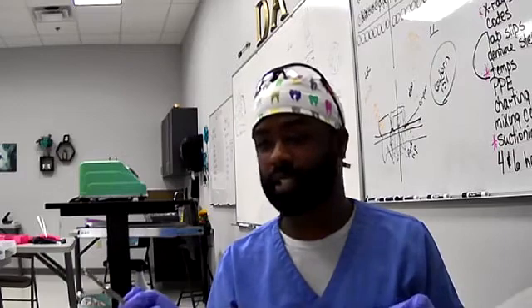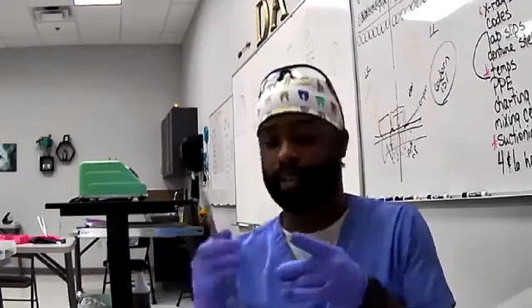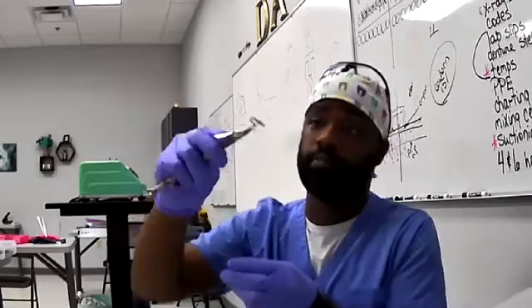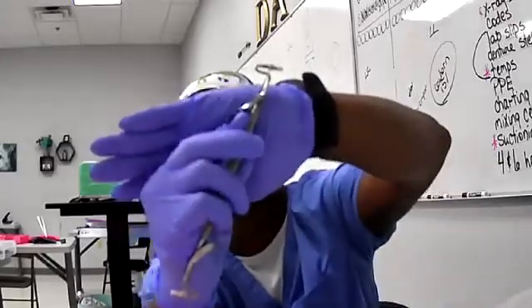So, for this instance, let's just say it was a pretty big cavity. So, I'd fill the big side, and you literally just, I hold my finger under, I know you can't see that, I'm sorry.